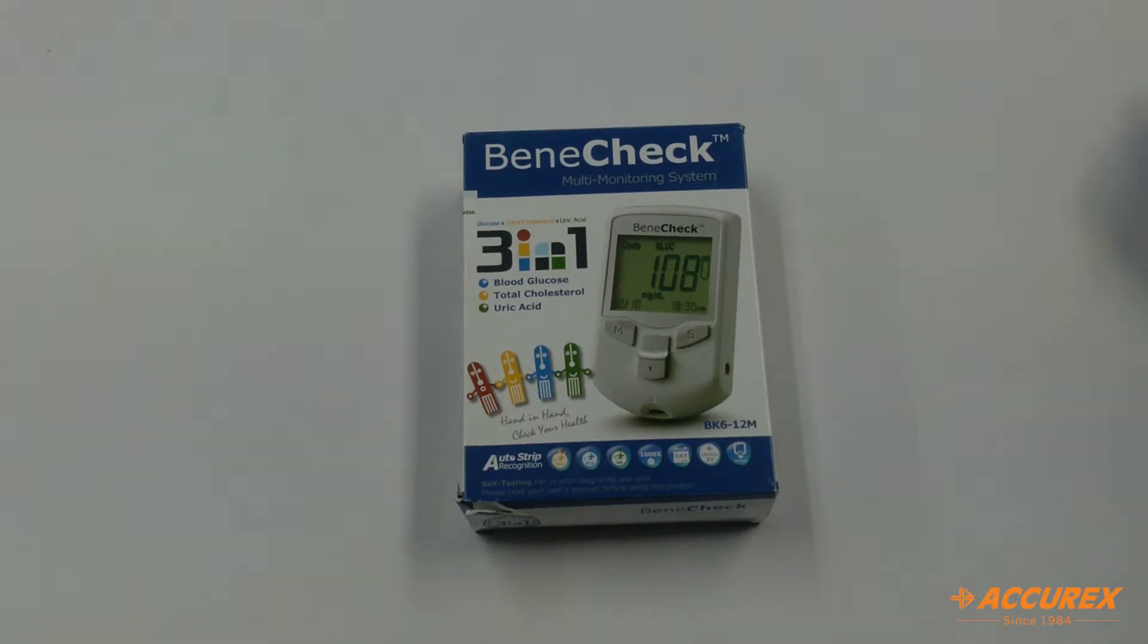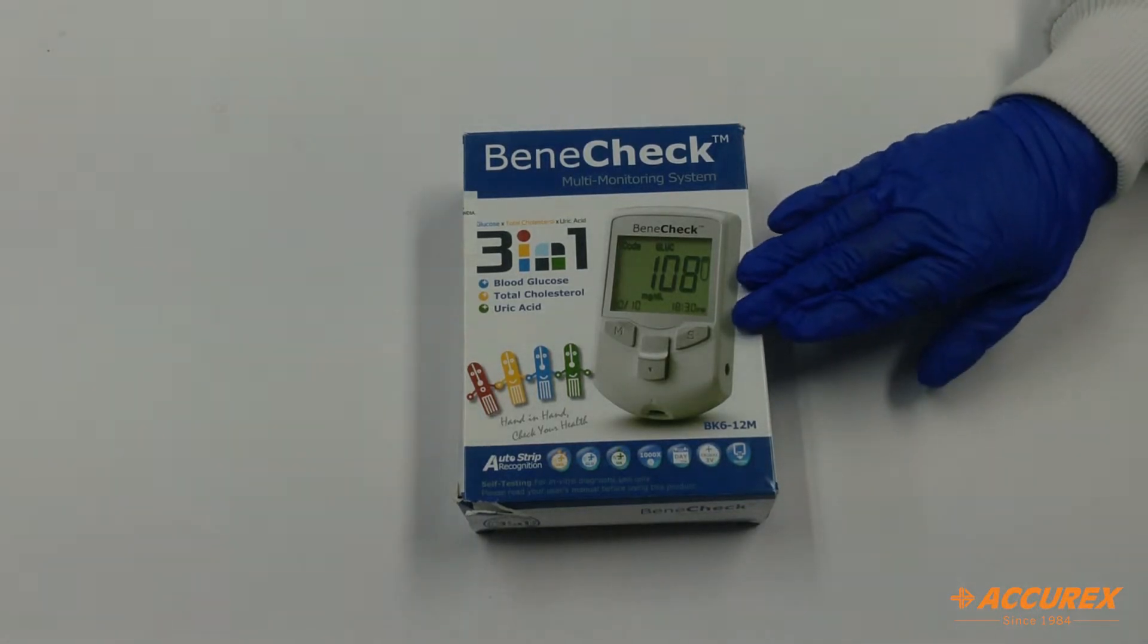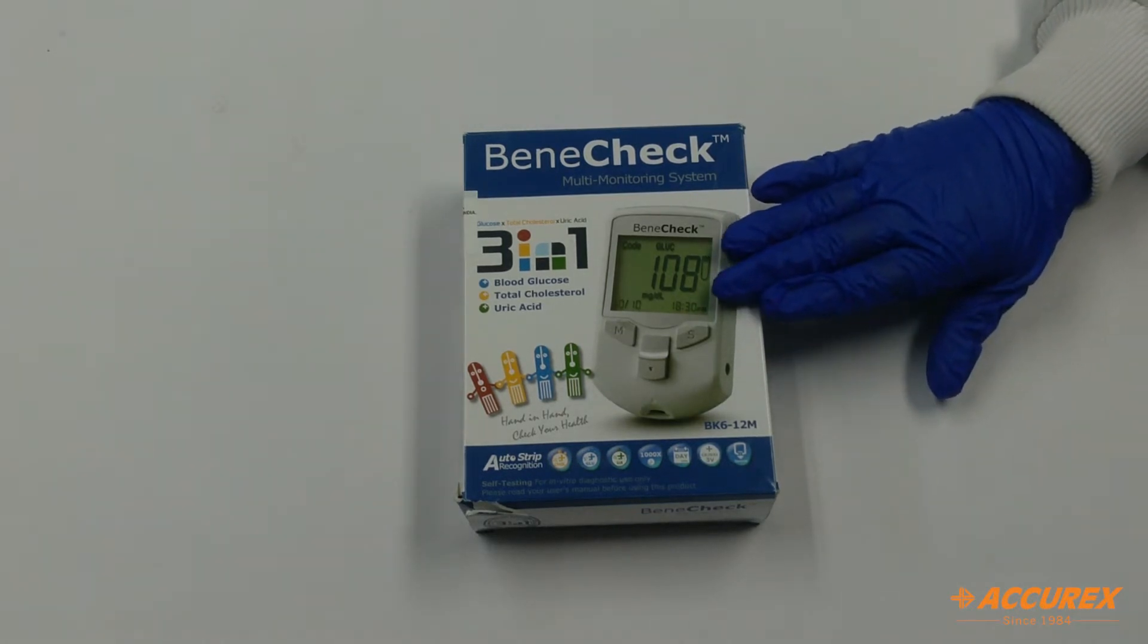Hello everyone, greetings of the day. Today we will see the Acurex BeneCheck multi-monitoring system which is the uric acid testing meter. From this we will check the uric acid level.